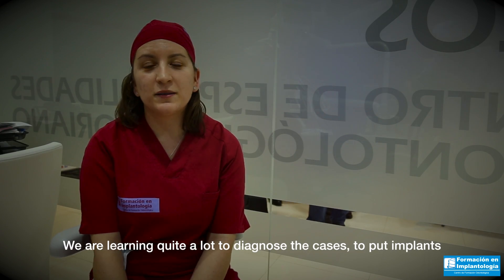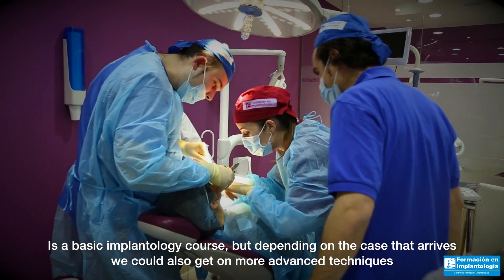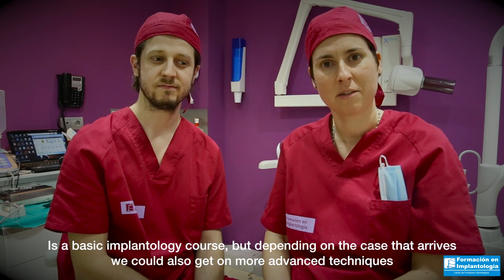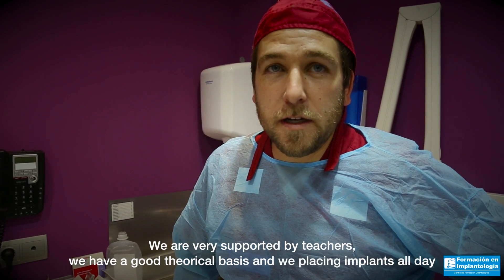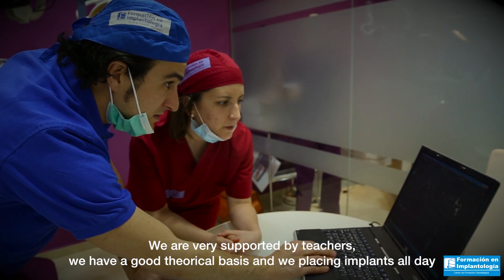We are learning quite a lot — how to diagnose cases and place implants. It's a basic implantology course, but depending on the case that arrives, we could also get into more advanced techniques. We are very supported by teachers, and we have a good theoretical basis. We place implants all day.